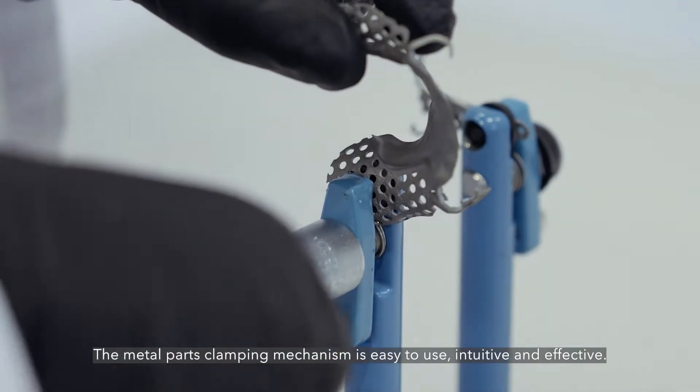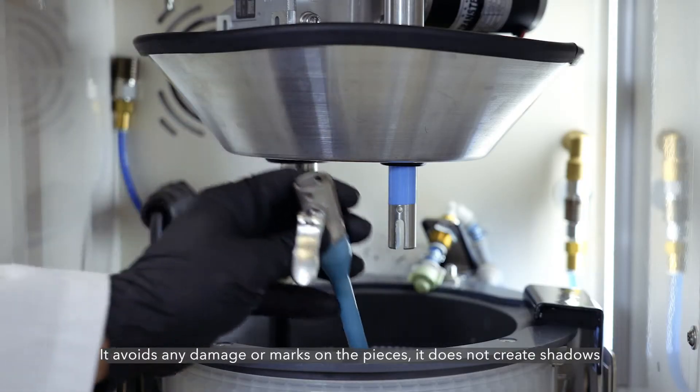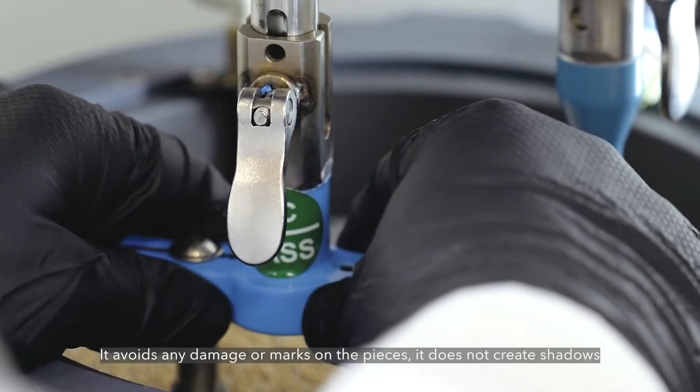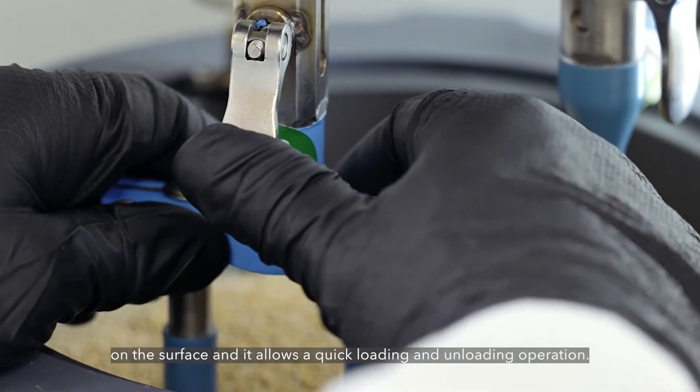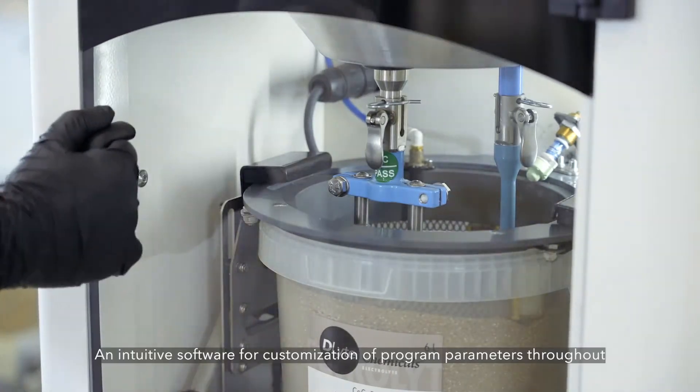The metal parts clamping mechanism is easy to use, intuitive and effective. It avoids any damage or marks on the pieces, it does not create shadows on the surface and it allows a quick loading and unloading operation.